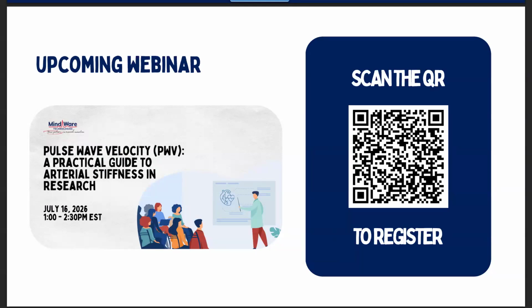So this webinar will really build off of the concepts that we talked about today, where we were talking about pulse transit time. Next time, we're going to be talking about pulse wave velocity, where we take this pulse transit time and consider the distance over which it's traveled, often when using dual impedance, in order to get an even better look at arterial stiffness and really speak to the time it takes that pulsatile waveform to travel. If you are interested in joining us, we also have a QR code here that you can scan and sign up for at this time.